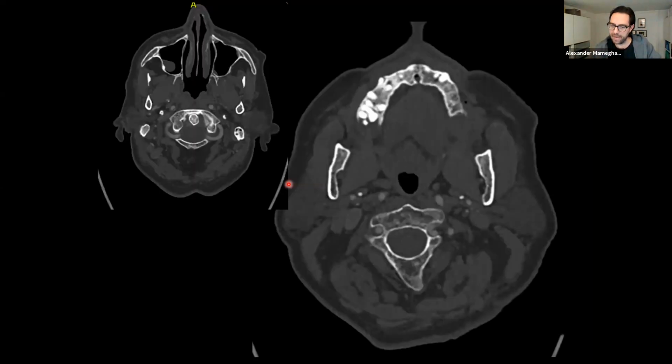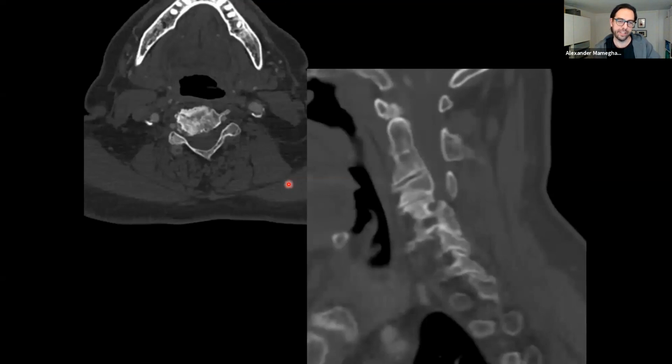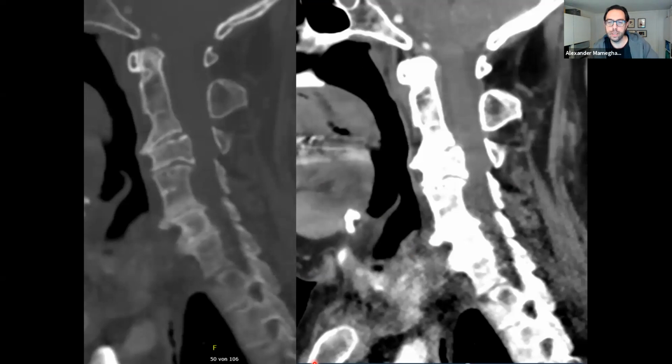So these are some axial views with this loop. You see here, hypoplastic lateral masses C5-6. You can hardly find any pedicle here big enough for a pedicle screw, but the lateral masses here, I don't know whether you can see my arrow, this laser pointer is difficult here, for treatment. These are the CT scans, and before I come to the MRI, is anybody interested in the MRI, or do you see the diagnosis even yet on the CT scan?